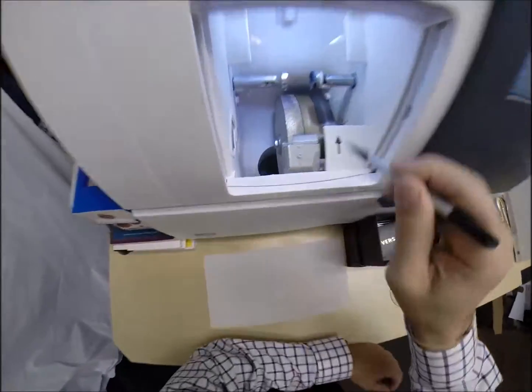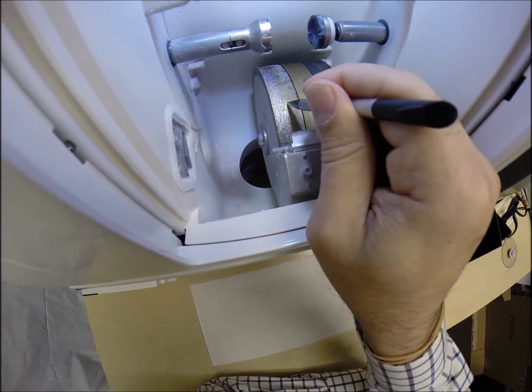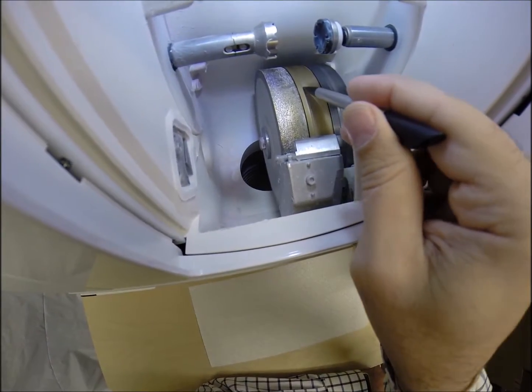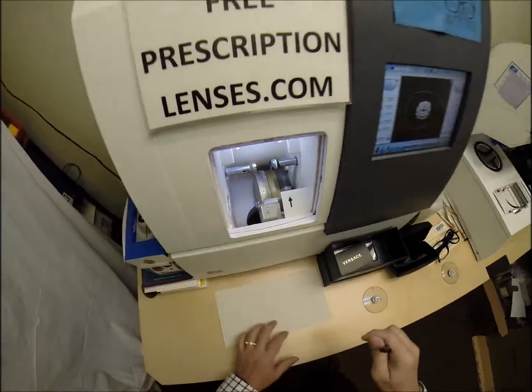Now the actual cutting wheel is over here on the far left. It's going to act like a heavy grit sandpaper. This is a diamond crusted wheel. It's going to grind away the lens material until it's the final size. This wheel in the center, that channel, that little valley, that's what's going to put the V-shaped bevel onto the lens so it stays inside the bevel of the frame.